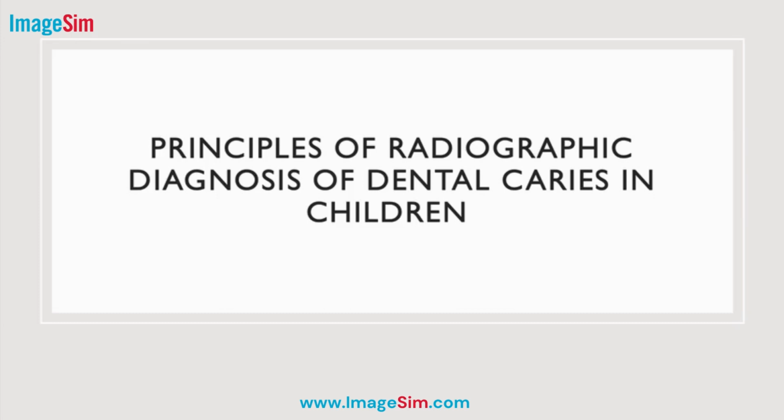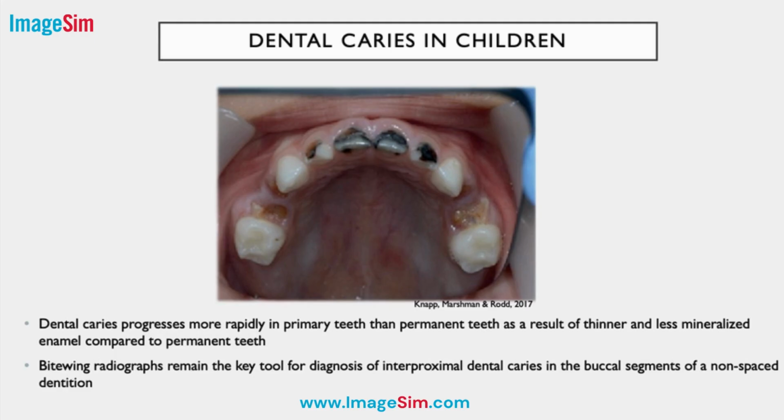Principles of Radiographic Diagnosis of Dental Caries in Children. Dental caries in children. Dental caries is one of the most common diseases of childhood.